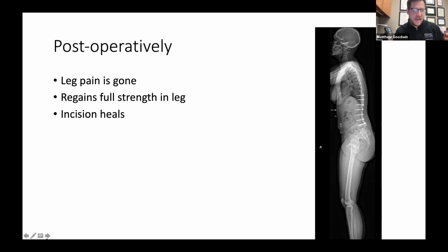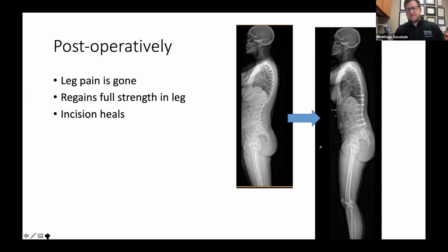So here she is standing up. Here she is pre-op to post-op. So clearly, Mike, exactly right. We've made her a little bit flat. I'm still hoping she's going to retrovert through her pelvis. She's going to use that remaining disc I gave her and maybe get to a reasonable spot.